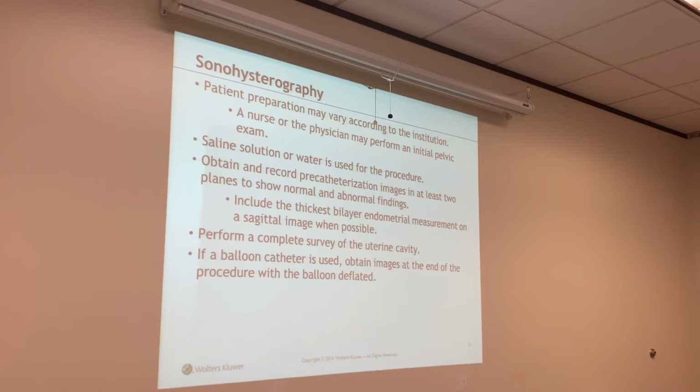Patient preparation is not usually much of anything unless they have to put a Foley catheter in. We do need a full bladder for which exam, transabdominal or transvaginal? Transabdominal. The bladder has to be full. Here at Harris Health, we no longer fill their bladder unless they come to us from the emergency room. Sometimes not even then. We do transvaginals on every patient except for when they're virgin.